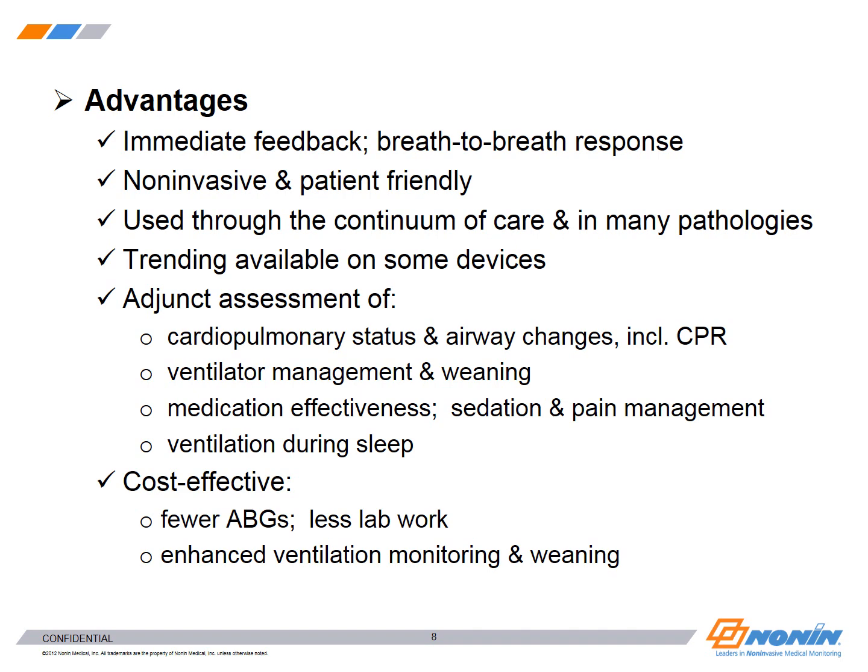The other thing is the cost factor involved here. If we had to draw serial ABGs during a procedure, or put the patient on a CO2 monitor, it is far less expensive to put them on a CO2 monitor.